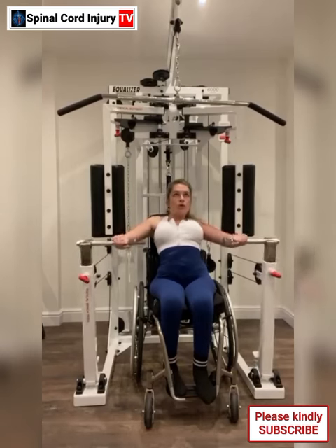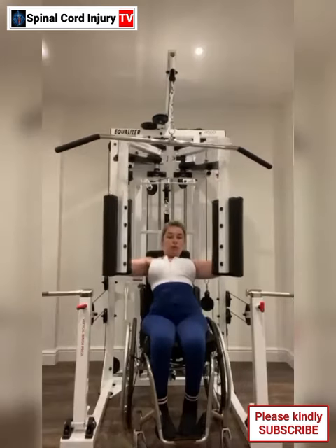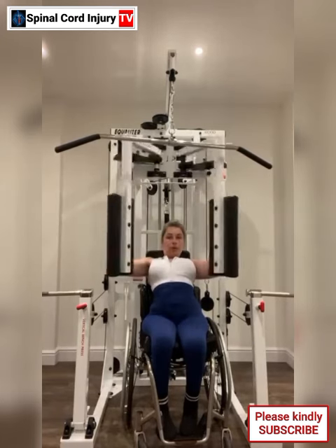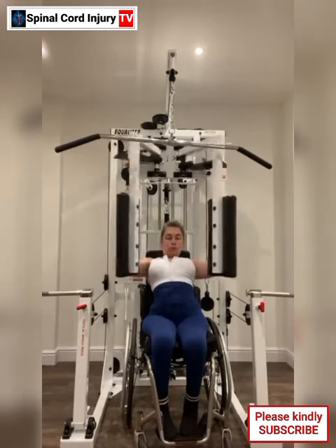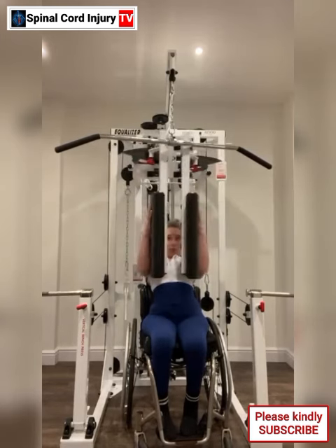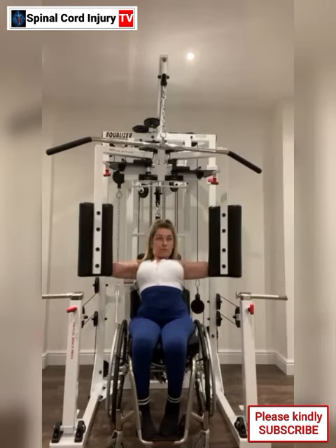Using an equalizer machine for exercise as a paraplegic can be a great way to work on your strength, flexibility, and overall fitness. These machines are designed to provide support and stability while allowing for a range of movements. Here are some tips to make the most out of your workouts with an equalizer machine.